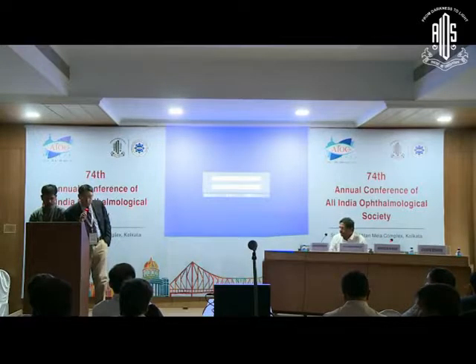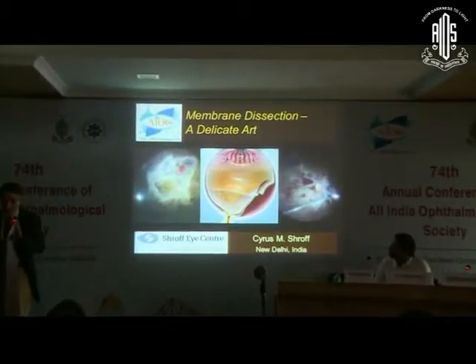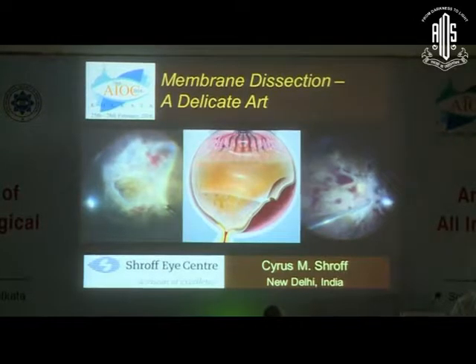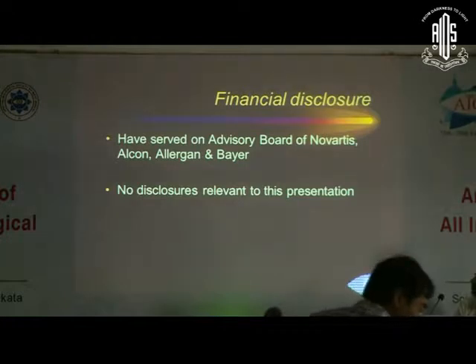Thank you, Dr. Sarvanan. And in the next few minutes, I'll be speaking to you specifically now more about the techniques of membrane dissection in vascular retinopathies.